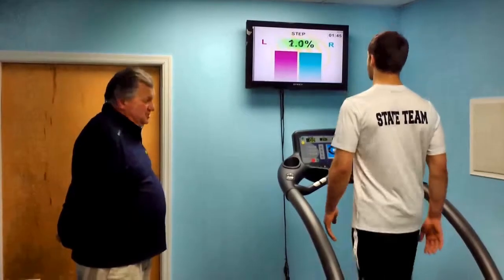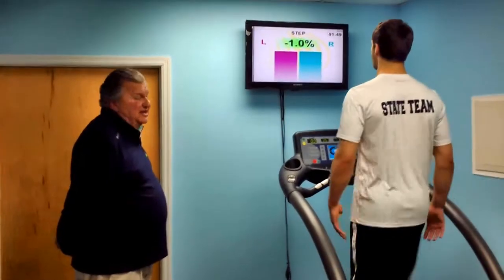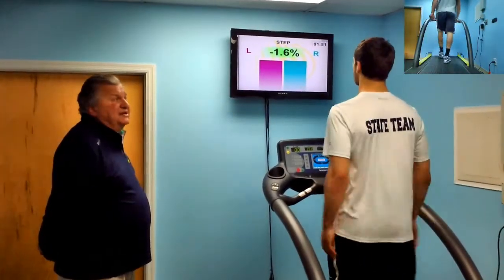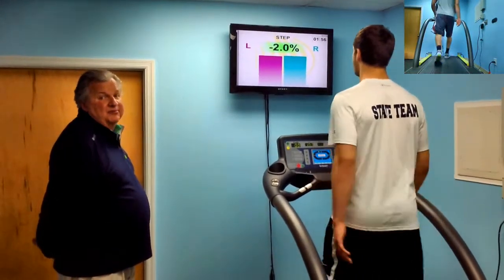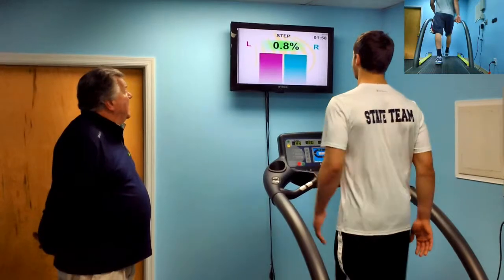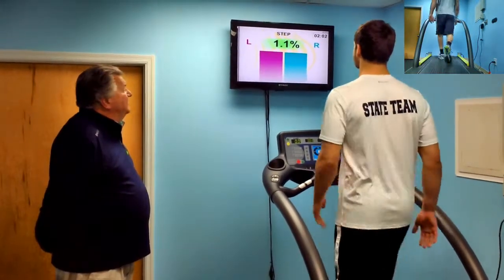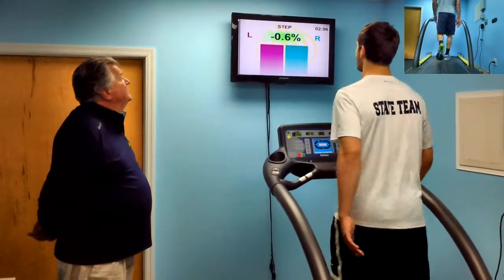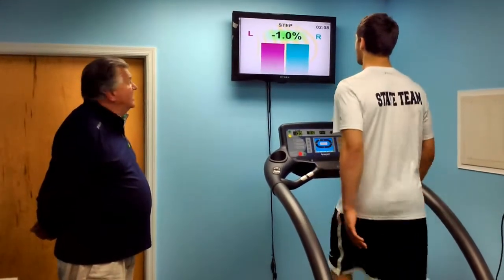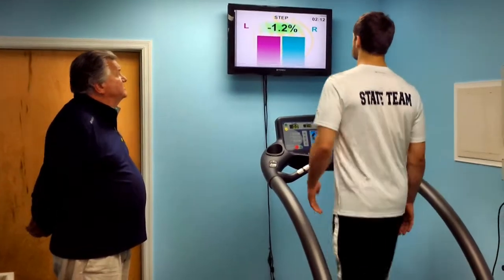Neuromuscular re-education. He's reducing the asymmetries in his gait cycle with each step that he takes, while he's getting biofeedback telling him the parameters of his gait cycle and the amount of asymmetry. Right now we're doing step length. He was off by 4.8%, and with some encouragement, he reached out with his right leg, and now he's hovering down in a fairly good zone of around 0 to 2%.